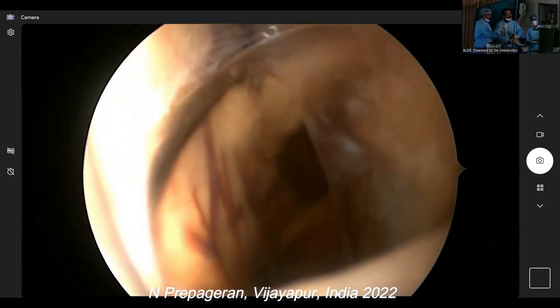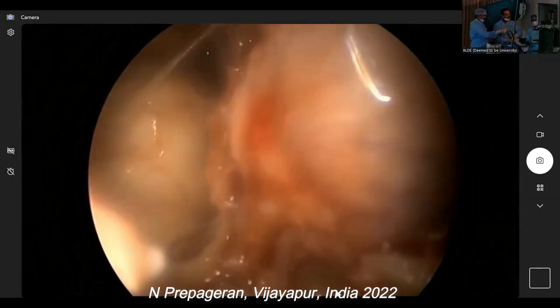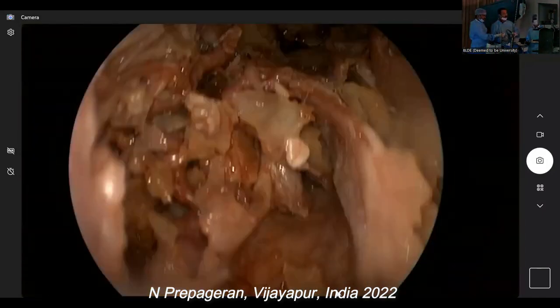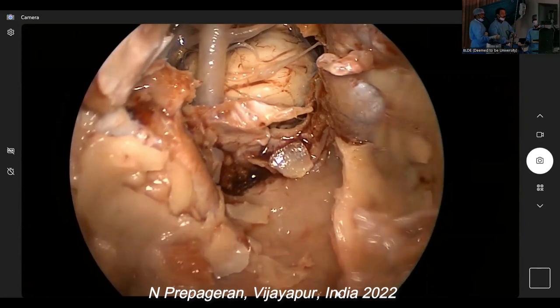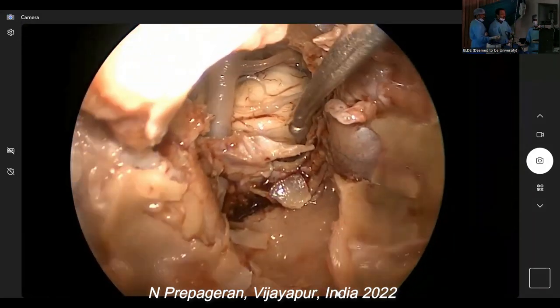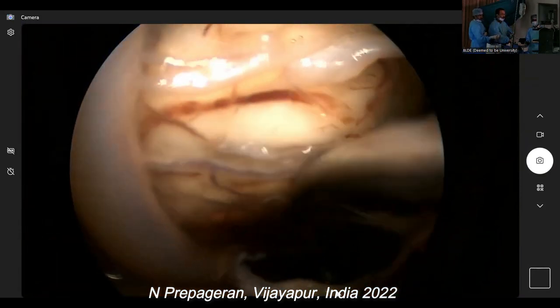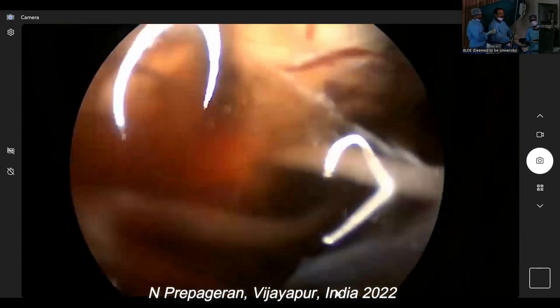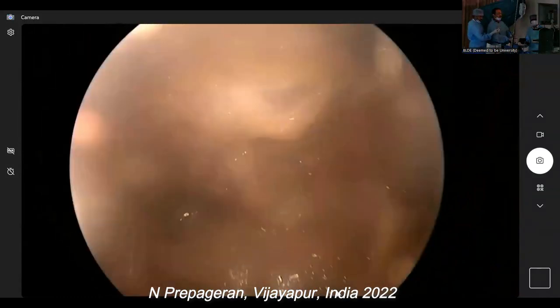Seven and eight, down there, guys. Yes. Can you see? Down there, seven and eight. And now I'm going to rotate the scope. The brain is falling forward, so that's the problem we have now. That's why you can't see properly. So now, let's see whether I'm able to see six. Yes. Nice, sir. And 9, 10, 11 will be down here. Vertebral artery. Okay?